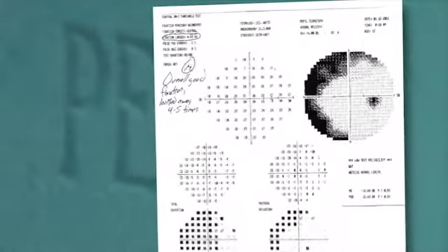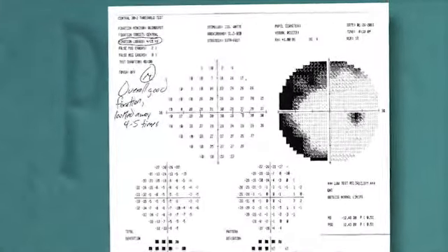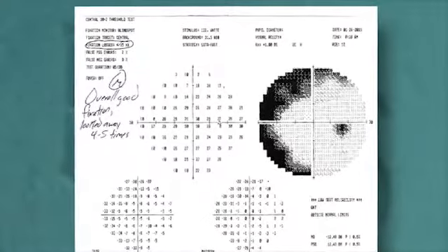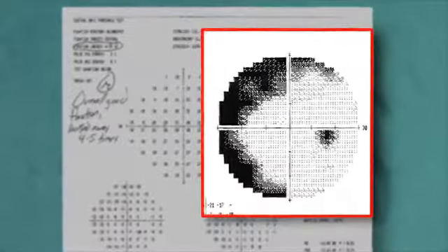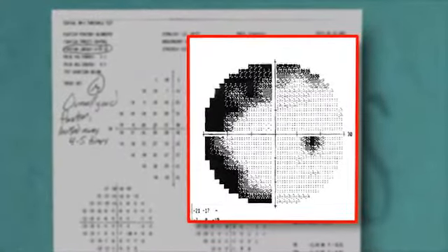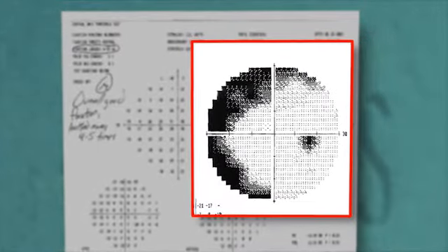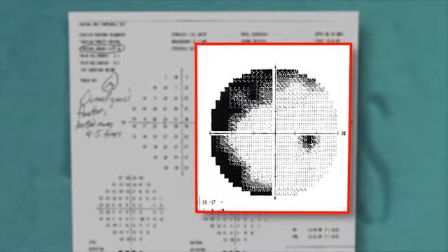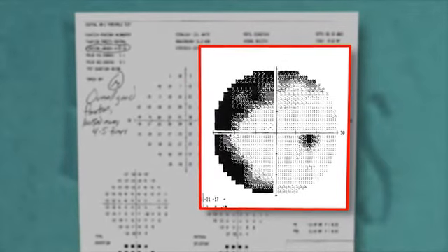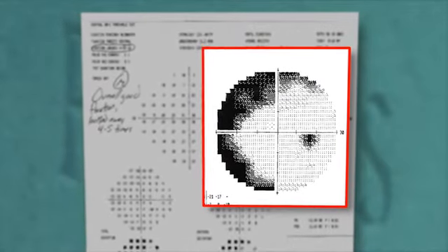Now we see the plot of a child with a vision abnormality, and the results are interpreted. For his right eye, it shows abnormality in the nasal portion. Remember, we talked about the nasal field and the temporal field. That's on the left. There are dark areas all along that rim, and that represents non-seeing. Where it's black, he doesn't see the target.